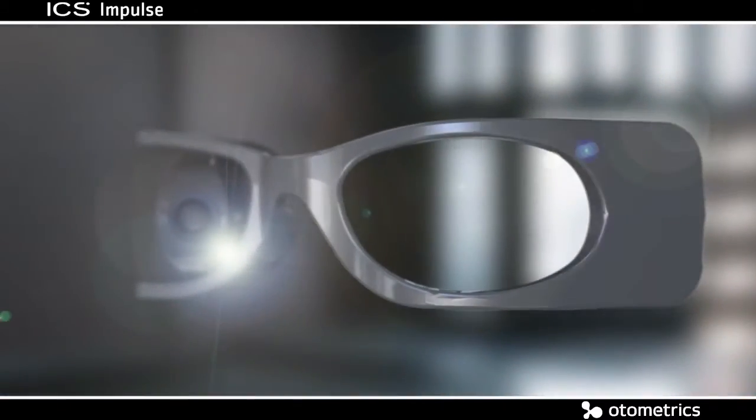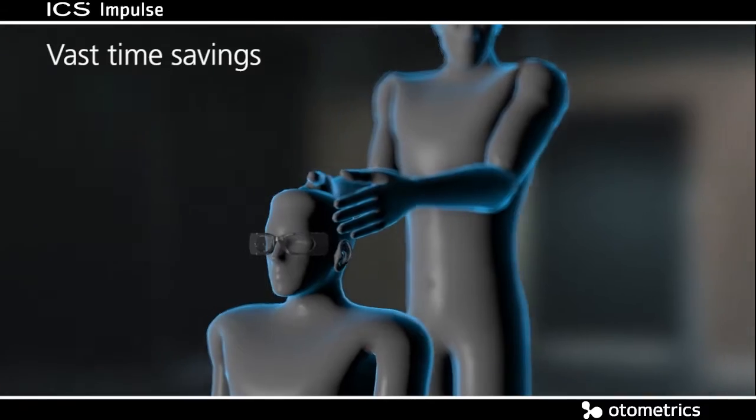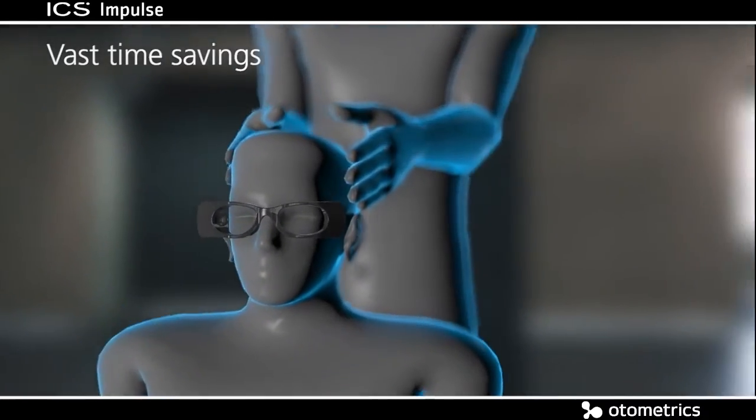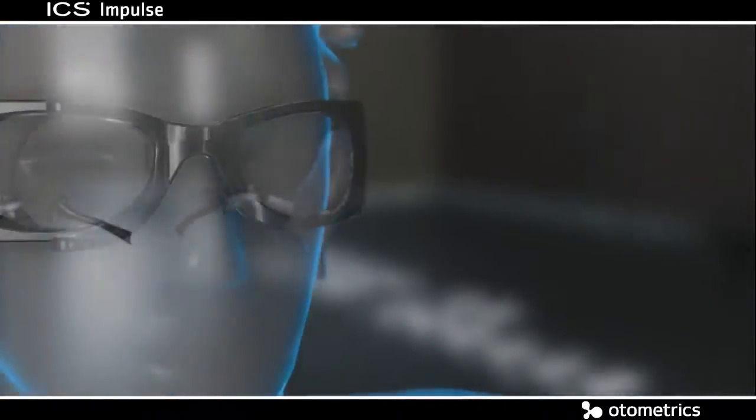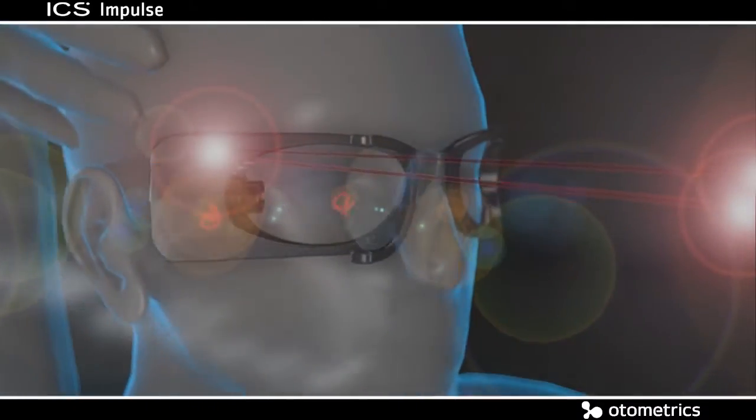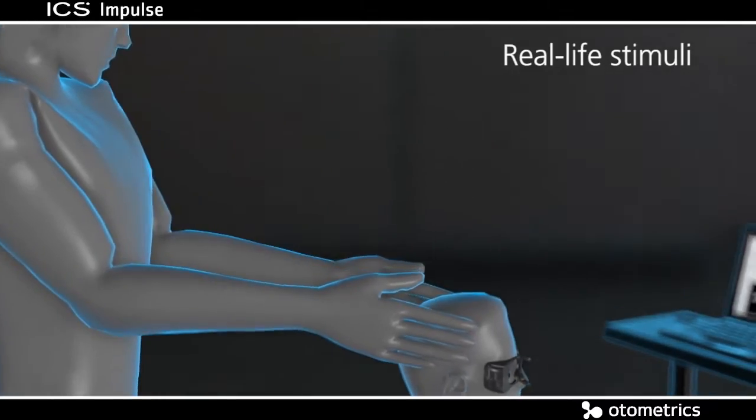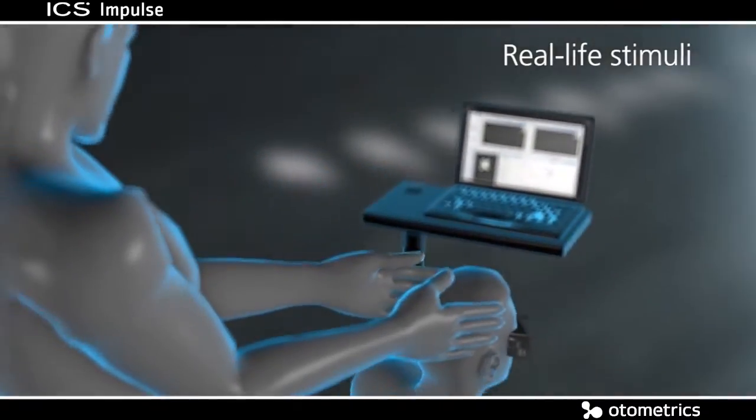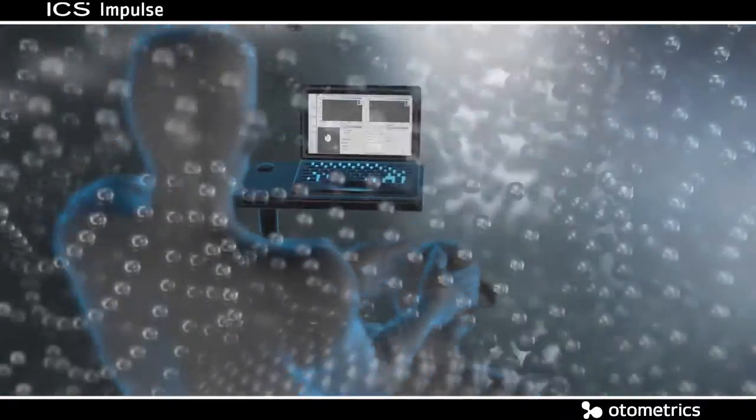It's very easy to fit the goggles on the patient. It takes a few seconds to do the calibration, and then you're ready to go. Within two minutes, we've probably done all the impulses you want to do and get the result right there.